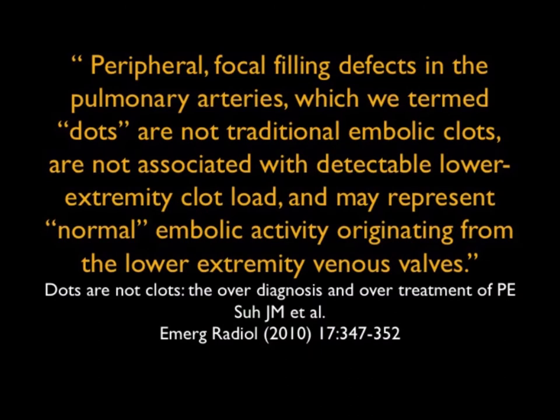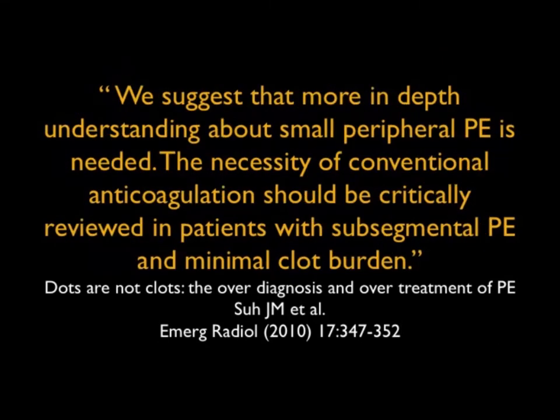Now, one can argue, and I won't discuss it at any length, about small pulmonary emboli incidentally detected on the non-coronary or non-triple rule-out studies, or even on triple rule-out studies. The question is, do you need to treat those patients? And I think at the end of the day, people always question what to do, but always do end up treating the patients. So it's indeed a challenge. But again, our job is to find the PEs. I think a little more science will determine, in many cases, how to manage the patient.